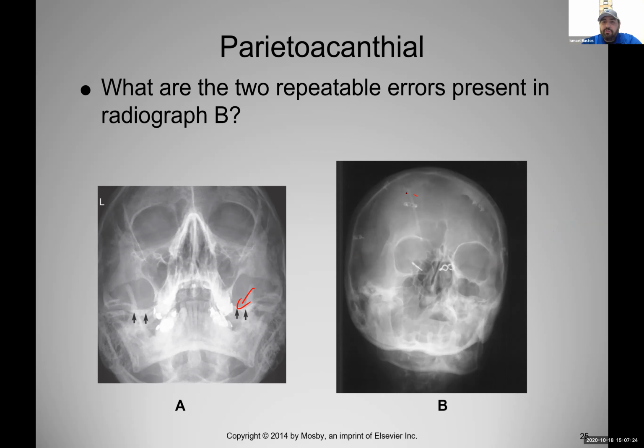But if you're looking at these structures here, you're saying foreign objects, those are hardware that they place to keep the skull in place, because you should see a line here of where they opened up the skull. So they took a piece out and then used that hardware to keep the skull in place. Here it looks like some sort of shunt that they put in the head. That line right there should be a shunt that they're trying to drain fluid with. So there's really no foreign body in there.